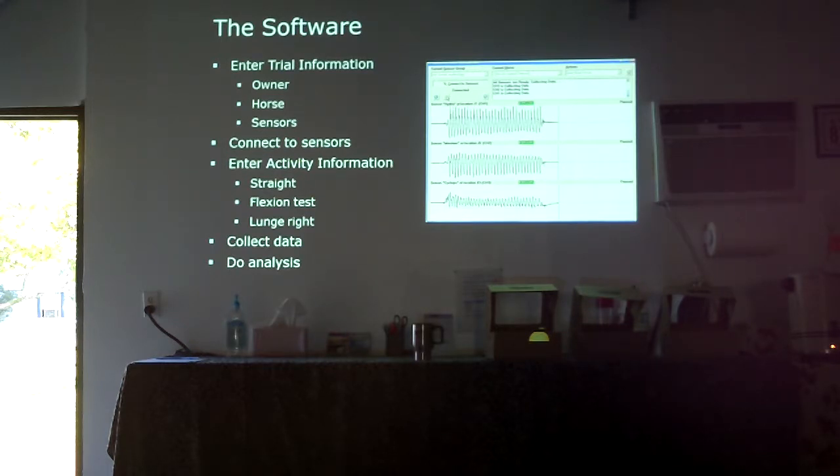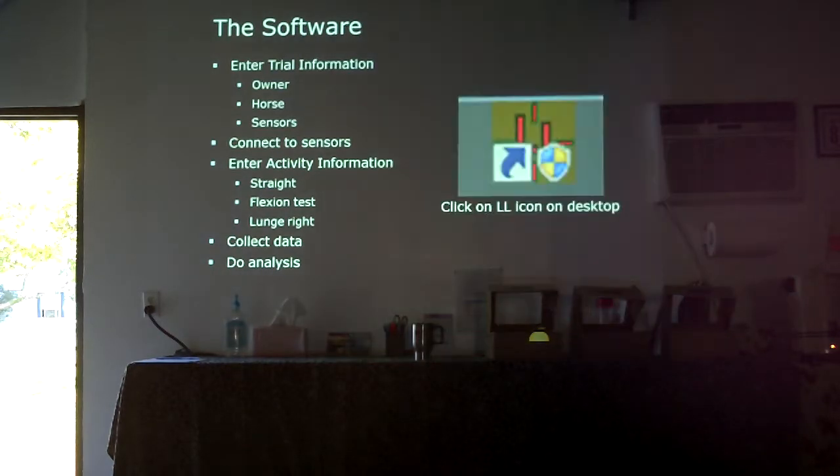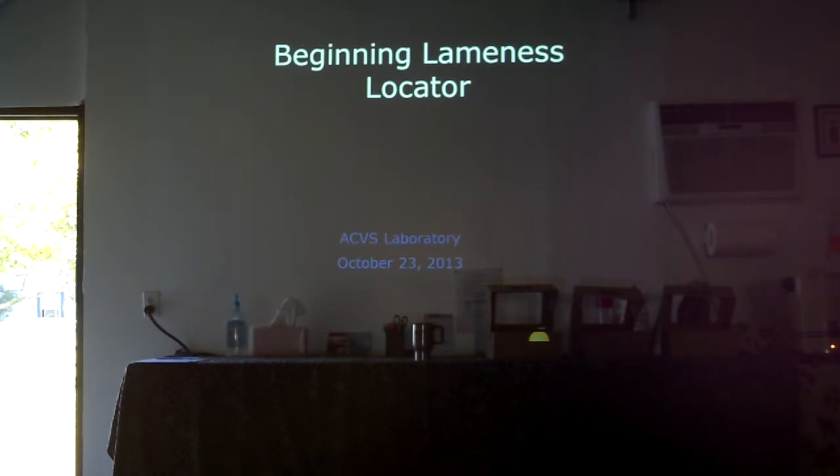But if you're interested in finding out more information, and if you have the 6th edition of Adams, there's a chapter in there on how to work through the software and how to do the analysis, what the plots mean. You can also go to the Equinosis website, and on that website are training videos, very short little videos, because I know a lot of people don't have time to watch a long video, on how to work through the equipment and how to interpret the analysis.